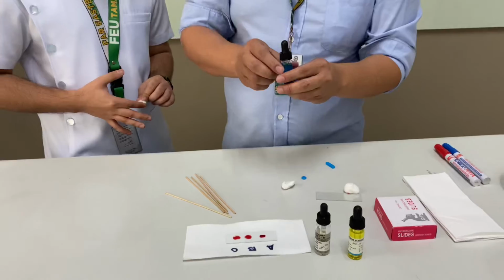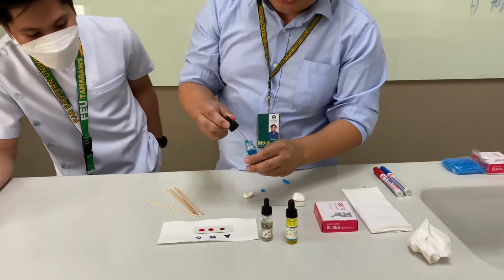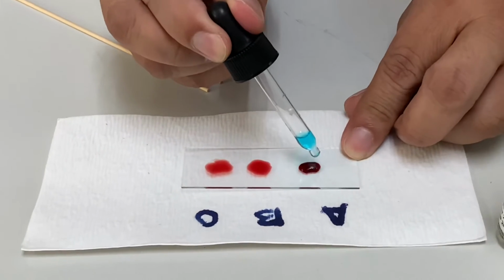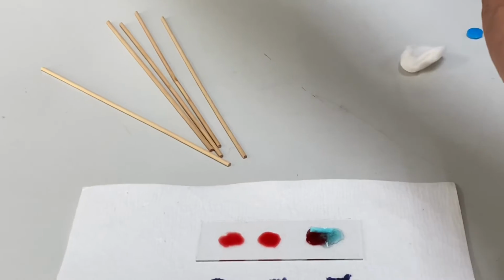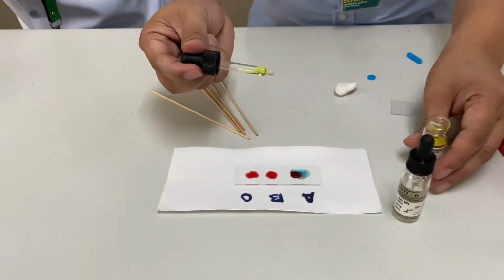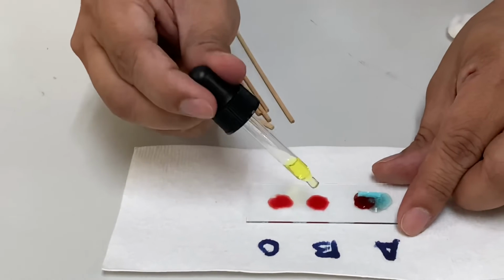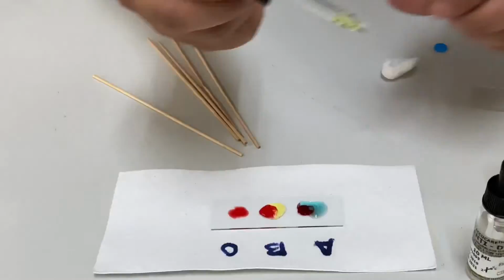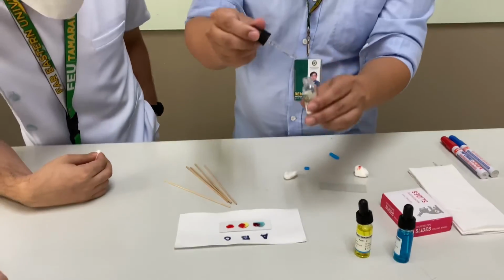Two to 3 drops of the anti-serum is enough before mixing it using the cotton applicator. 1, 2, 3. And then this is the anti-serum B. You may notice the color, it's yellow. And then the anti-D, which appears transparent.